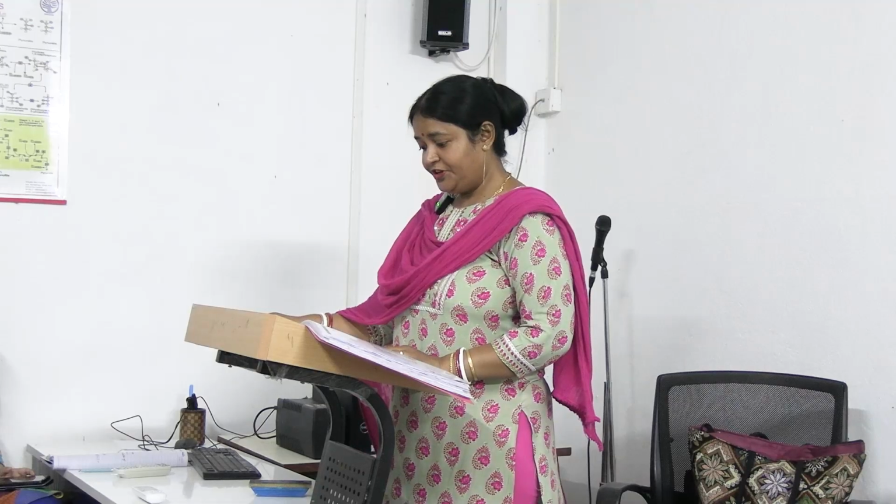So the principle I told: red color quinoneimine dye will be formed and the intensity of the color is proportional to the concentration of cholesterol in the sample. And which sample can you use? You can use serum or EDTA sample. All that you can use. And light path will be 1 centimeter.